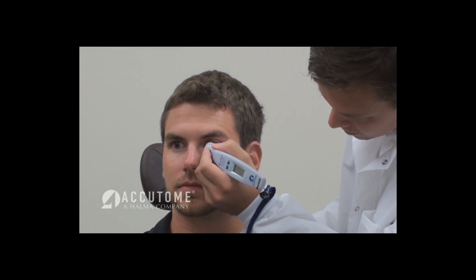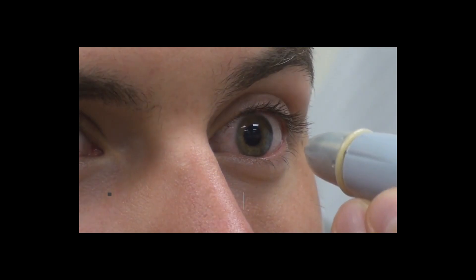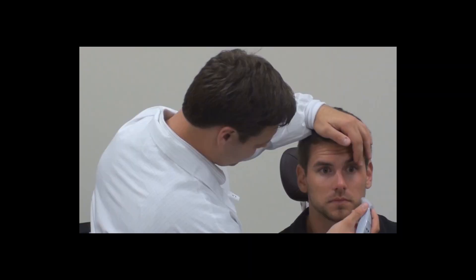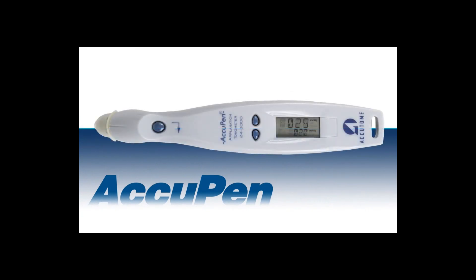Gently tap the transducer tip on the patient's cornea. The probe should be perpendicular to the apex of the cornea, and measurements should be taken at the center of the cornea. When the unit is being properly applied to the cornea, the unit will produce short chirps followed by one longer chirp.